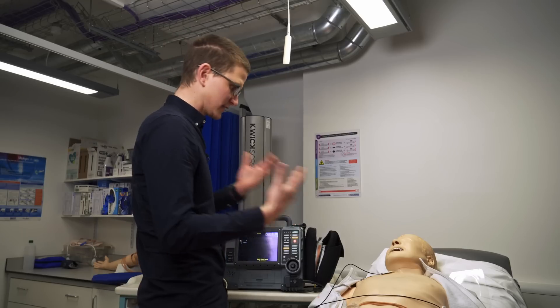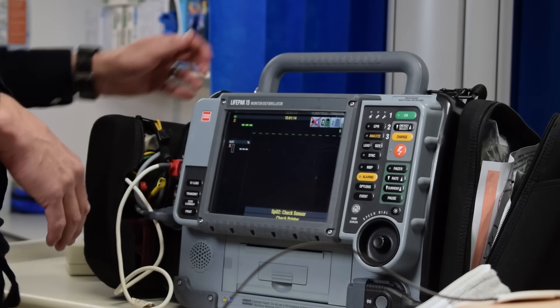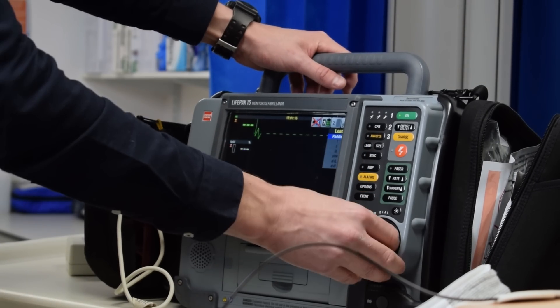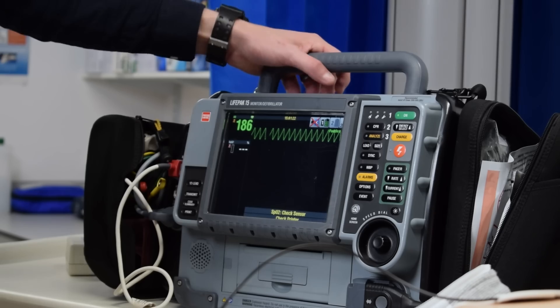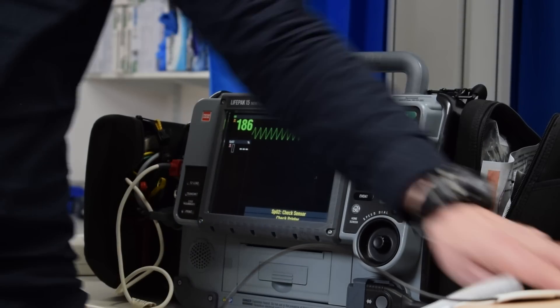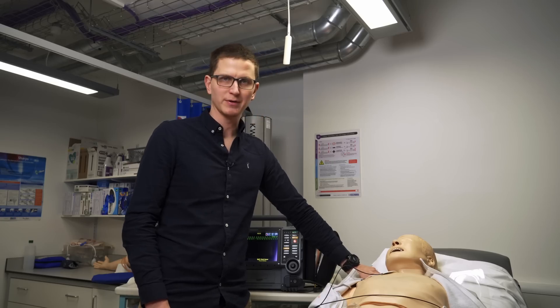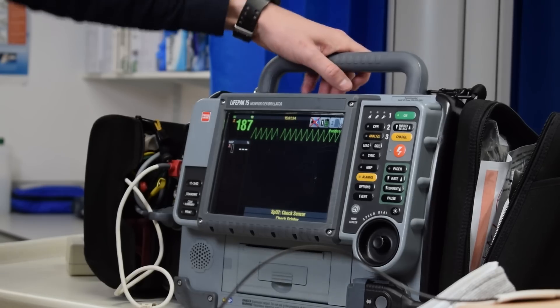So we've got our consent, patient is unconscious, we've taken their blood pressure, they're hypotensive. We're going to put our monitors on. You do not actually need your leads on but you do need paddles. We have our rhythm here, there is a VT. Patient's in VT, I feel their carotid pulse — they have a very rapid carotid pulse and they are in a fast wide rhythm. So a VT.